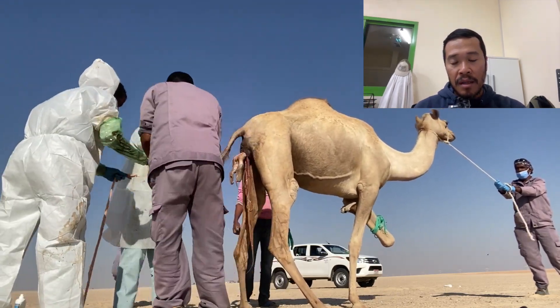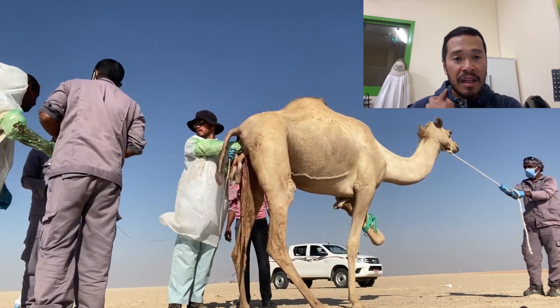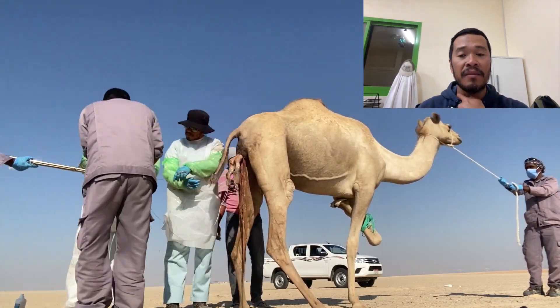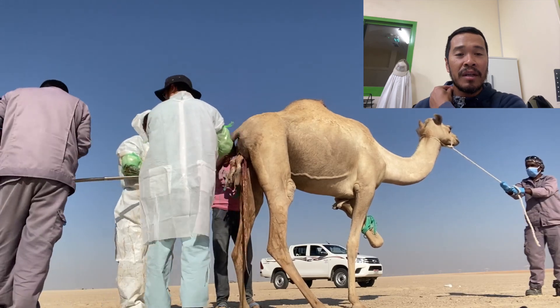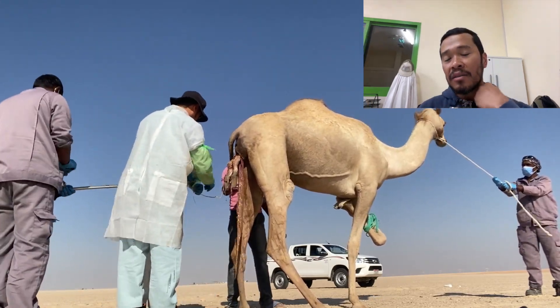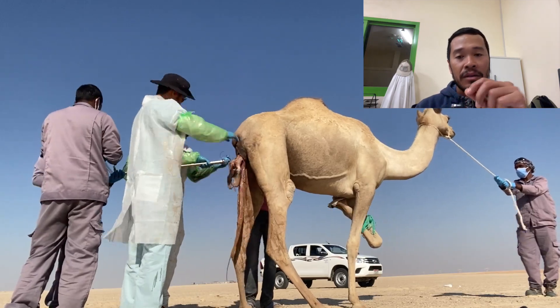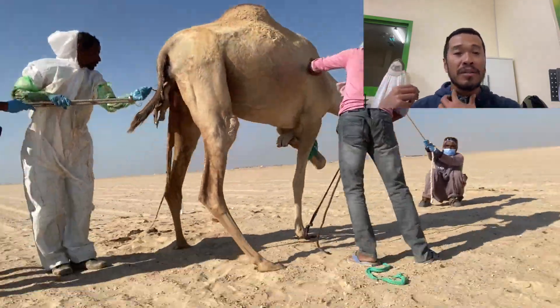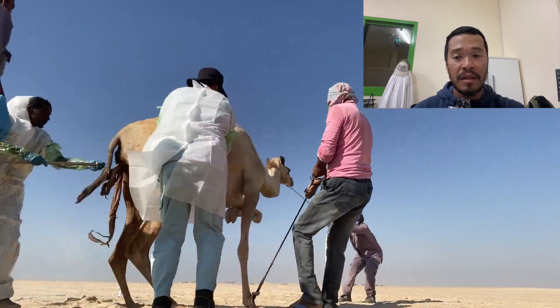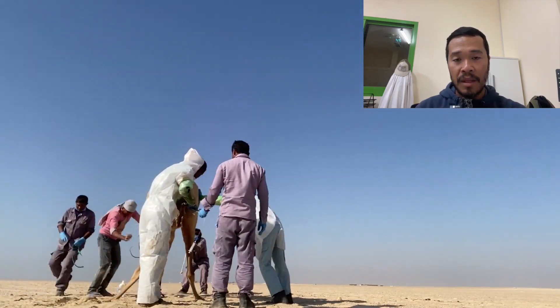My supervisor and I examined the situation and agreed to tie a rope around the cervical area of the fetus. I inserted my hand, ran the rope under the neck and back over the other side, then pulled it. Once it was locked in place, we attached the wire saw to one end of the rope and pulled it through so the wire saw would be positioned at the cut site.